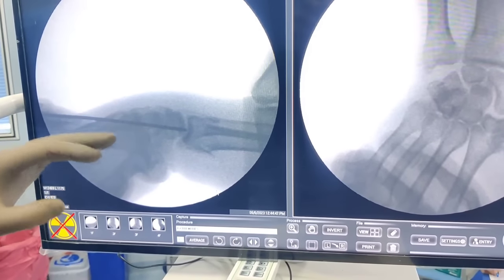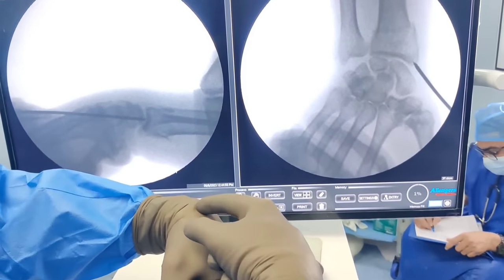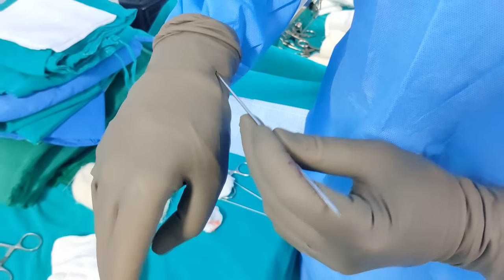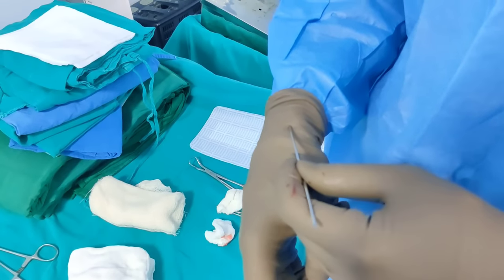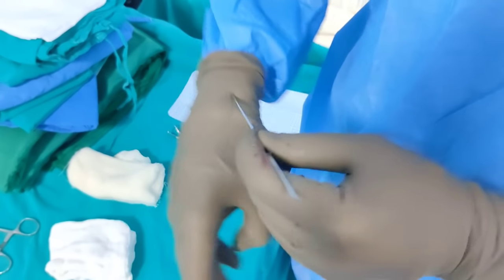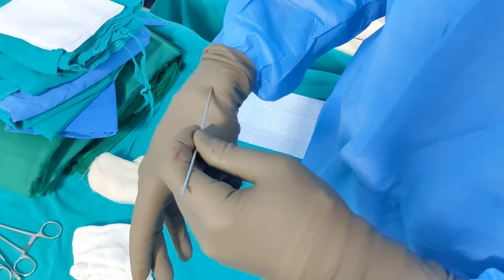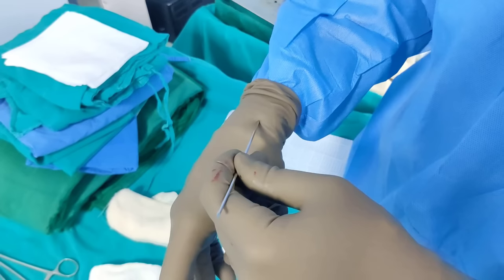You may not be lucky all the time. If the wire is going dorsal, you change the entry slightly towards the volar side. Similarly, if it is going volar, bring it slightly dorsal. Say for example this is my trajectory and I have fixed it — I am not going to change it. But if in lateral the wire was volar, with the same AP trajectory I am going to shift it slightly dorsal, then check again until I am happy in both AP and lateral. An ideal wire will go from the radial styloid right through the center of the radius.